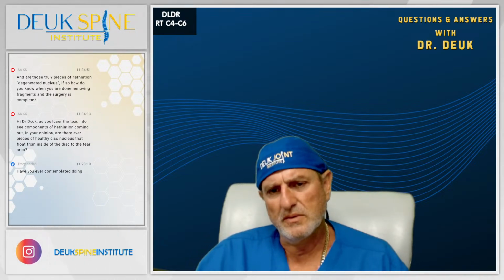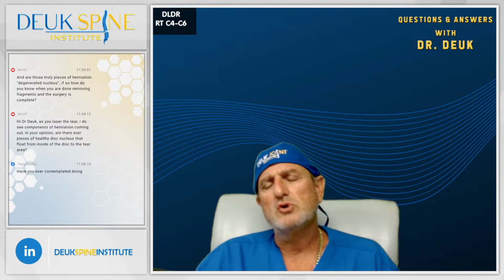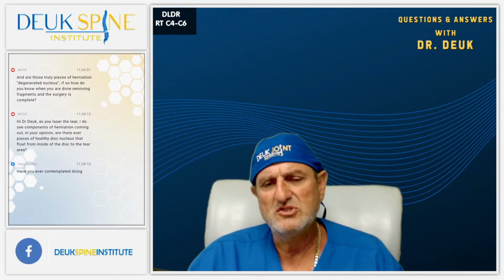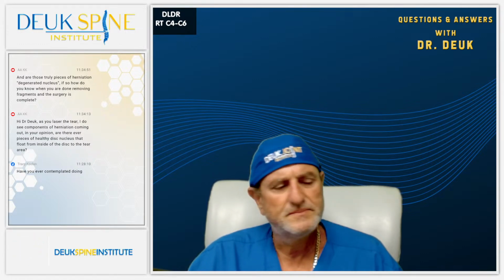Deuk plasma rhizotomy deadens the pain nerves to a joint that's painful. Superior cluneal nerves or cluneal nerves, we would do. I don't think we've done the cluneal nerves, but we would. Absolutely. It's a safe procedure. And if it works, man, that'd be awesome. So get in touch with us. Let's do an MRI review and let me make the diagnosis, and then you come here and get it done.